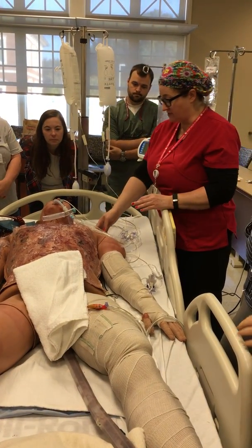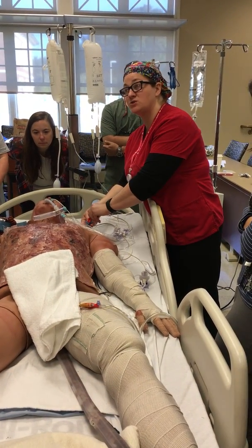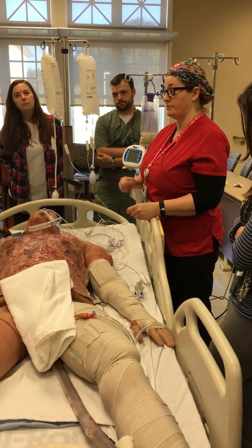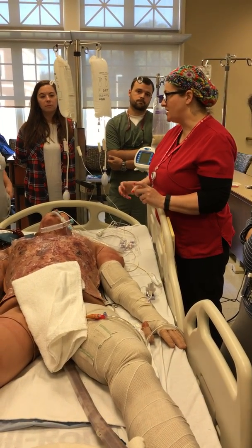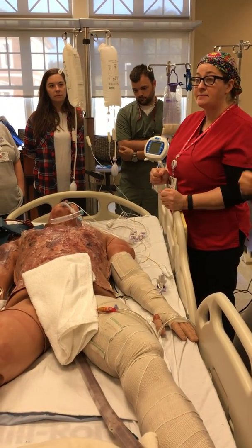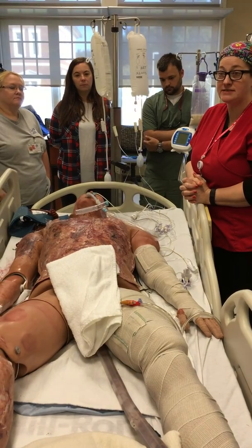I love LiDCOs for the simple fact that you just connect it to one of their lines here, and it connects to a machine and it reads everything out for you. There's no wedging or anything like that. Now, what is a normal CVP? 2 to 6, right?